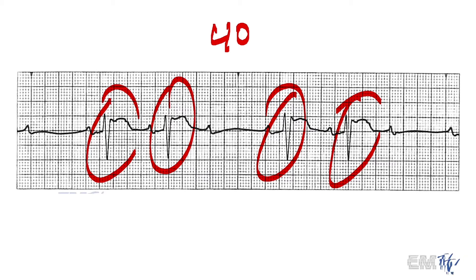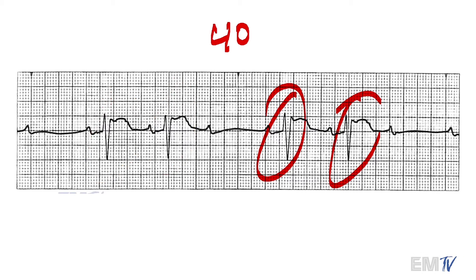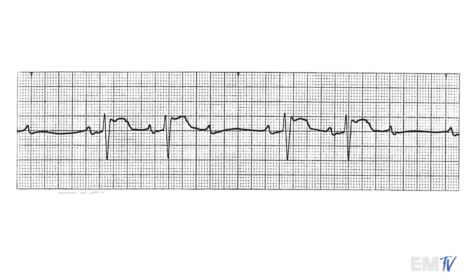One other thing you should notice here is you're seeing more P waves than there are QRS complexes. This should immediately clue you in that this is some sort of heart block. More specifically, this is usually going to be a variation of a second-degree heart block.